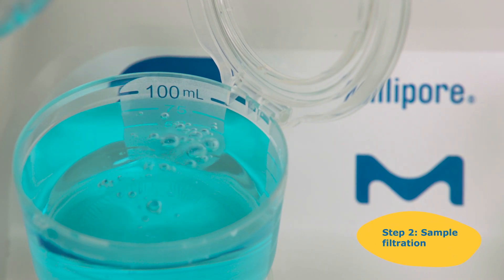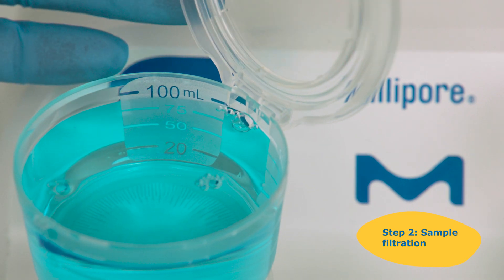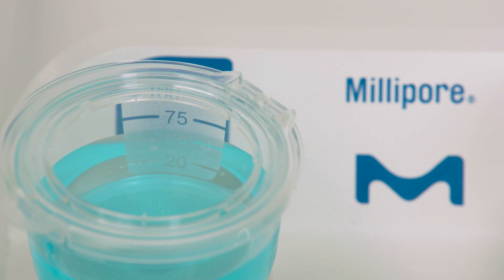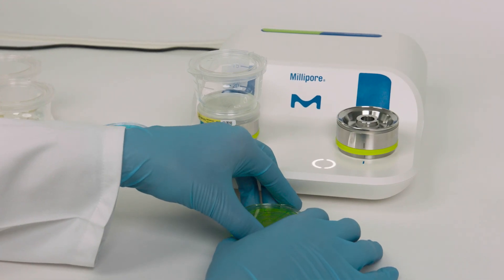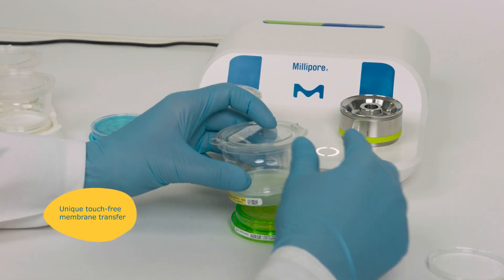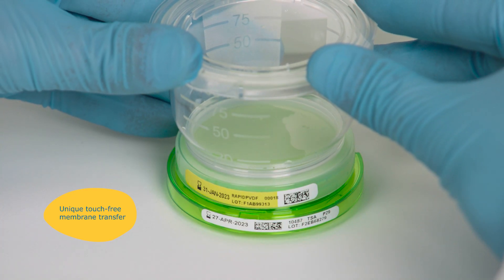Pour your sample through a pre-sterilized, ready-to-use and disposable Milliflex Oasis filtration unit. Then transfer the membrane filter onto a Milliflex Oasis agar plate.